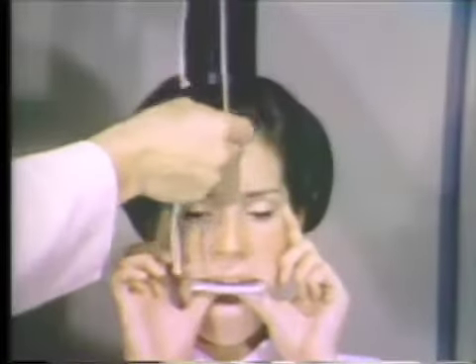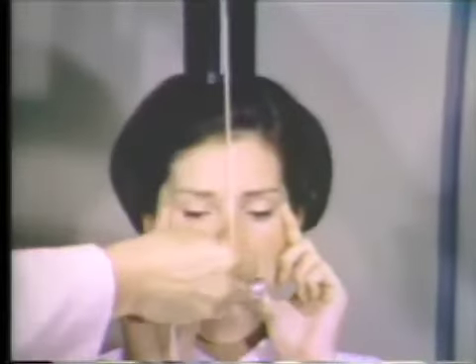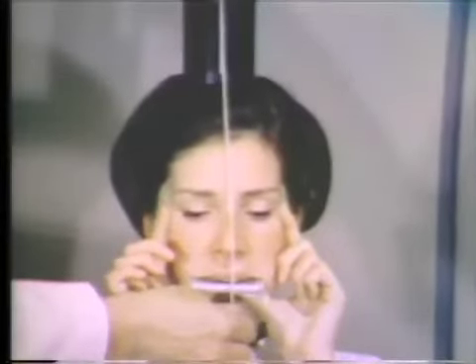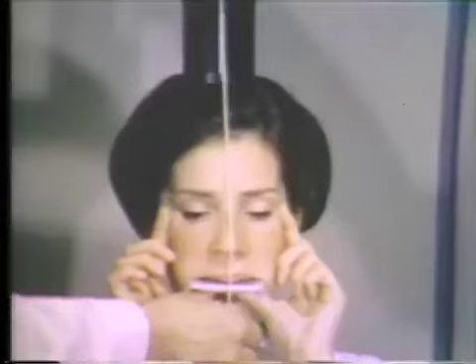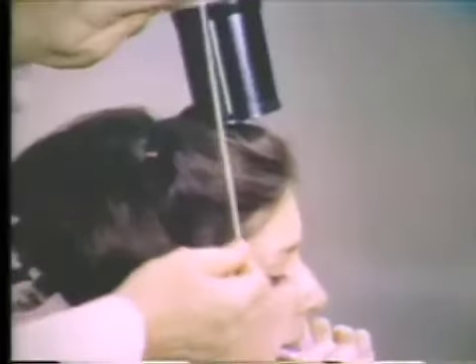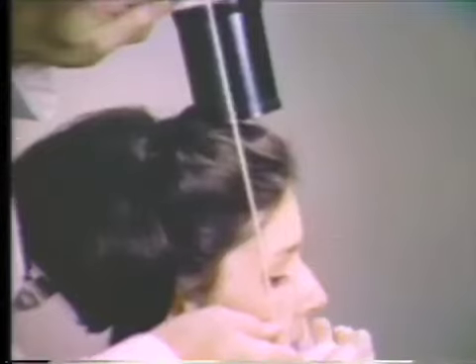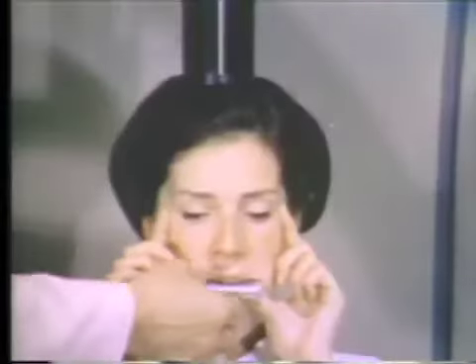For this maxillary cross-section occlusal projection, the X-ray cone is positioned above the head. From the front, the central ray must be aligned with the mid-sagittal plane. From the side, the 75-degree angulation should direct the central ray to the center of the film. The outer corner of the eye is a convenient reference point. The exposure may then be made and the patient dismissed.